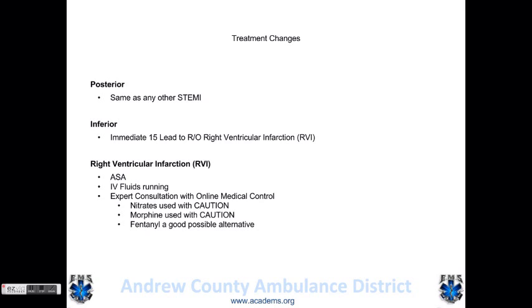We're probably going to be taking pictures with cell phones, if we have anybody's cell phone, and transferring those right to the cardiologist. That's something that's coming down the line that Mosaic is doing right now. Buchanan County's working on doing it. So it's something we're going to be looking at doing maybe in the future for those that carry their cell phones and those that want to.